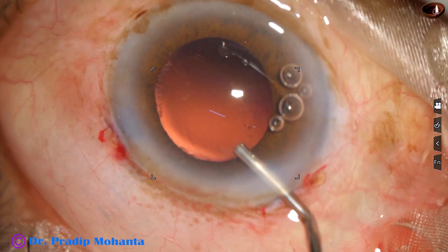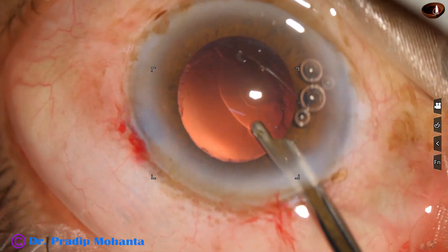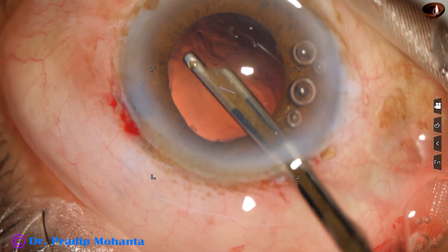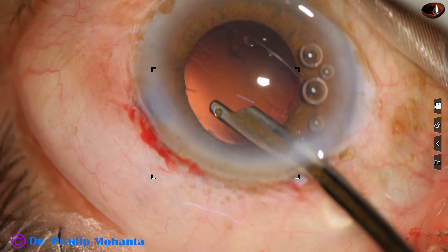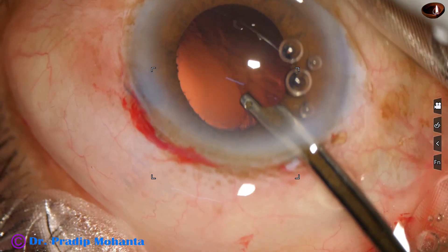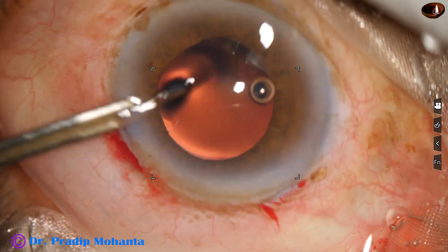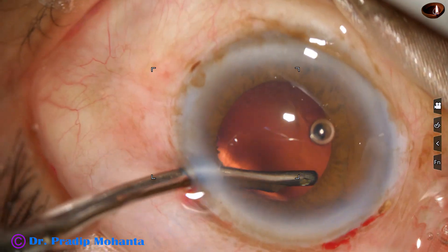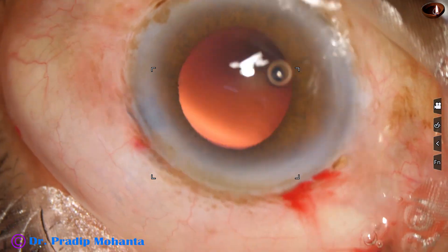A little amount of visco, and we cannot see the cortex — if it is there, it is covered by the iris. So I just sweep the Simcoe cannula and if cortex is there, it gets caught at the aspiration port. It is done.